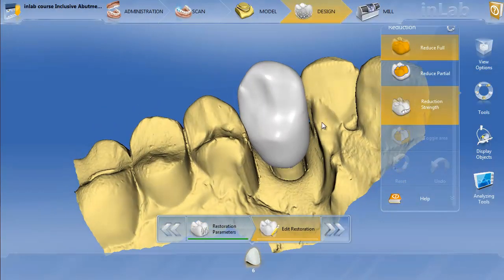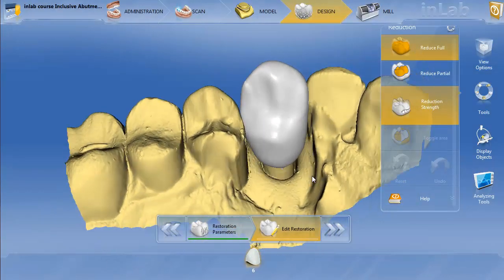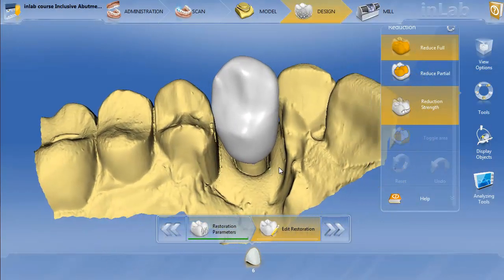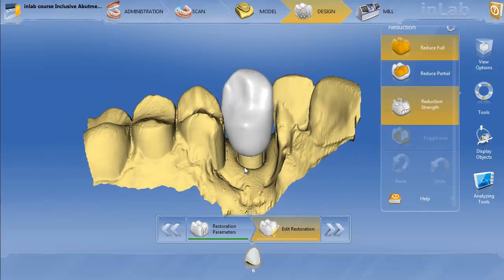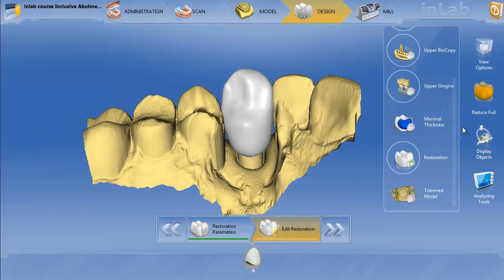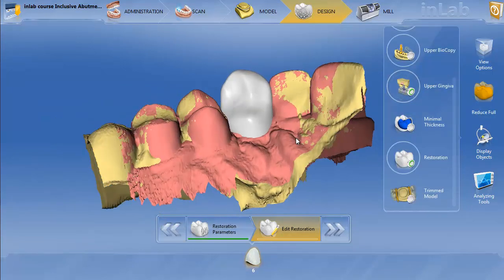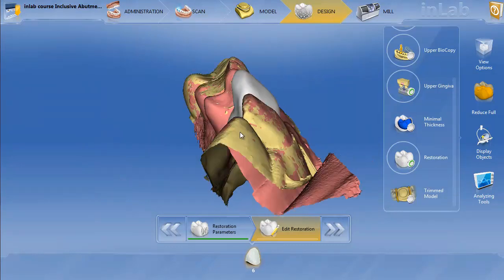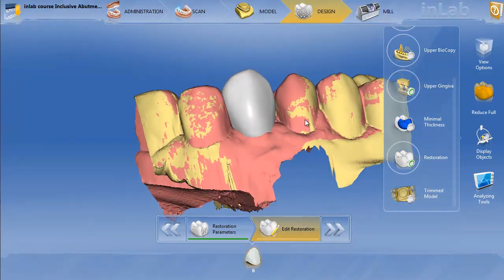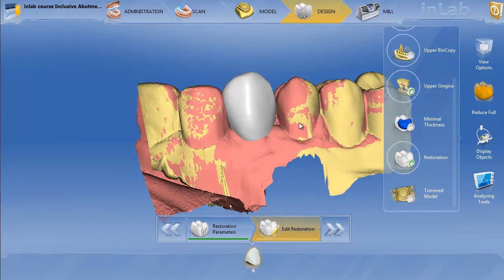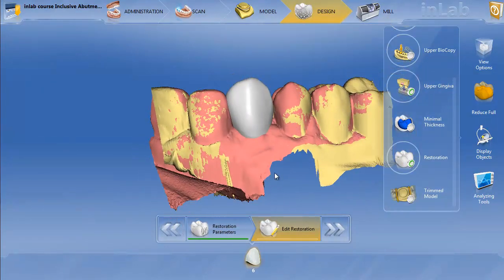So now I'm back to my original restoration. I did this with the gingiva mass, so if I want to go ahead and turn on my gingiva, you can get an idea of where the emergence profile is.